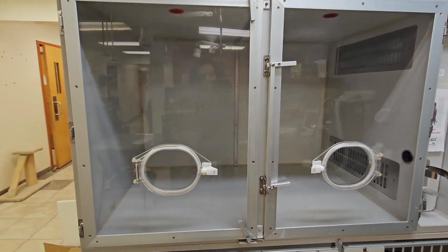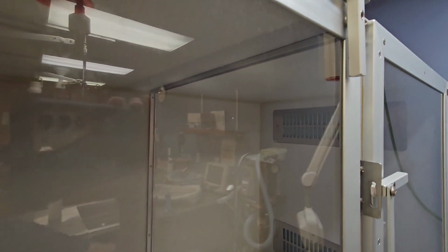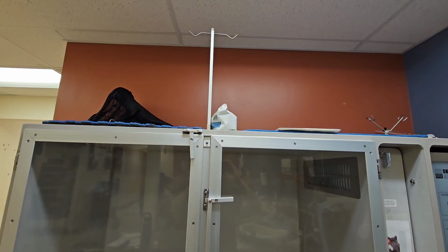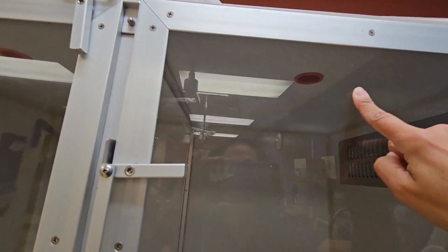Probably unlikely, but if we were to ever have 2 patients that needed to be in oxygen, behind the unit are these divider walls, and you can lift that up and slide it in that groove at the top, and it fits in the groove in the back. And also, if your patient is on IV fluids, we'll generally hang the fluids from that hook up there, and there are holes in the ceiling that you can drape the fluid line through. So you'd want to get your fluid line through there first, obviously, and then you would hook it up to your patient.